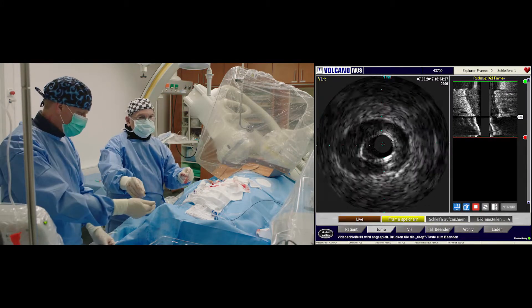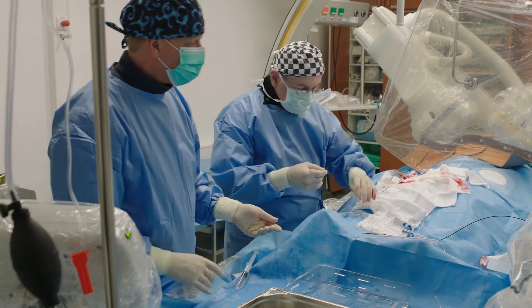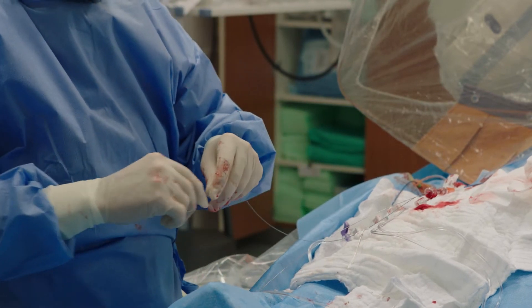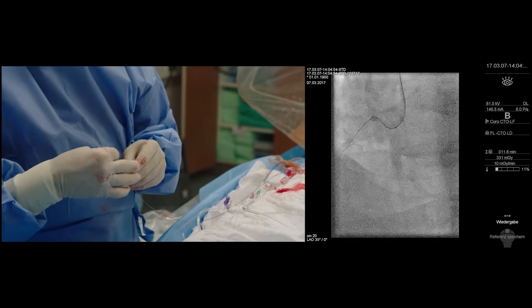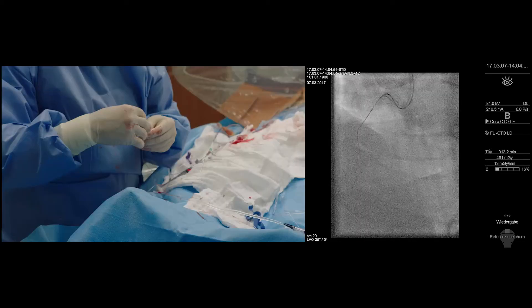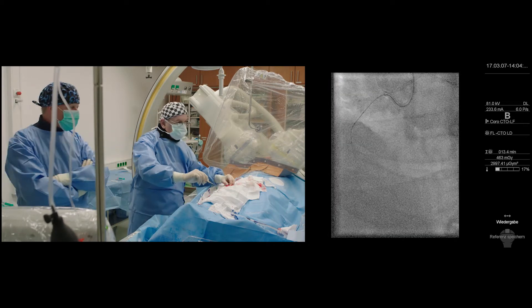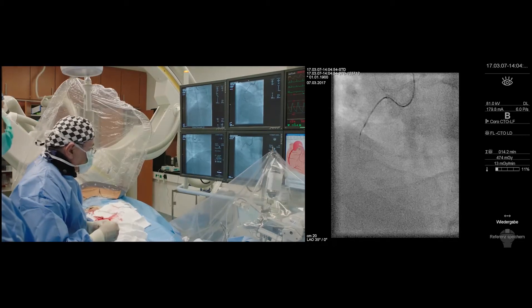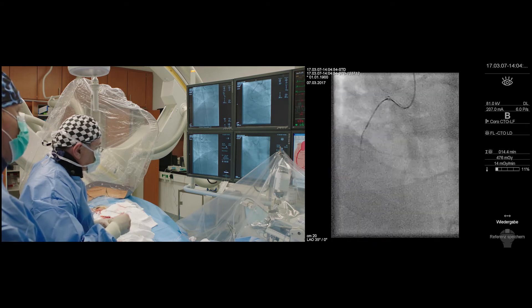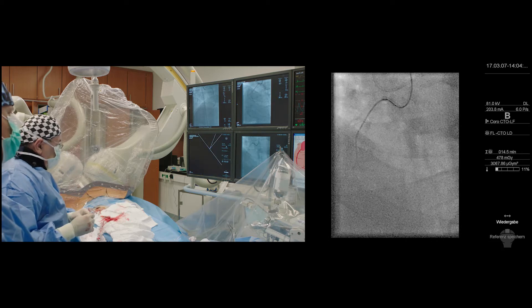So the lesion is probably in the middle of the artery. The plan is: with a vessel of 4 mm diameter on a relatively straight segment, to try wiring, and then if the wire is sub-intimal, try parallel wiring. The wire advances easily. The question is: is it intimal or sub-intimal? It feels like the whole system is backing out. So we do parallel wiring — we want to exit here and go parallel down. The first wire is not far off the target; I just use it as a rail to see whether we go a different pathway.